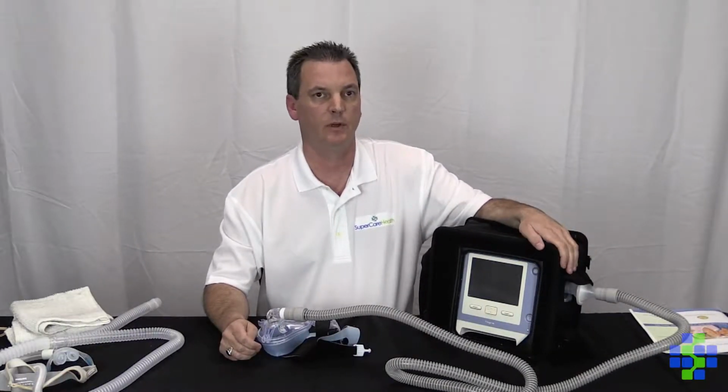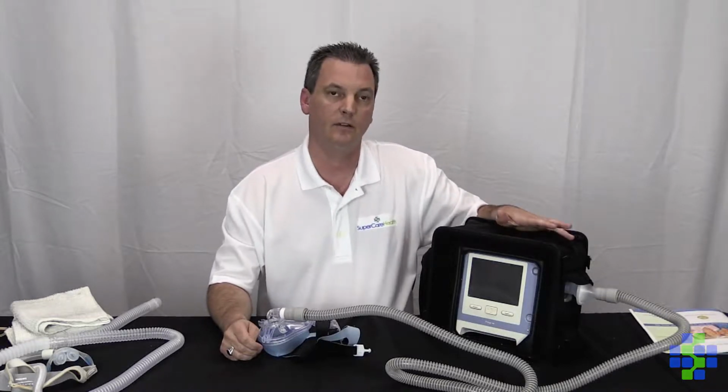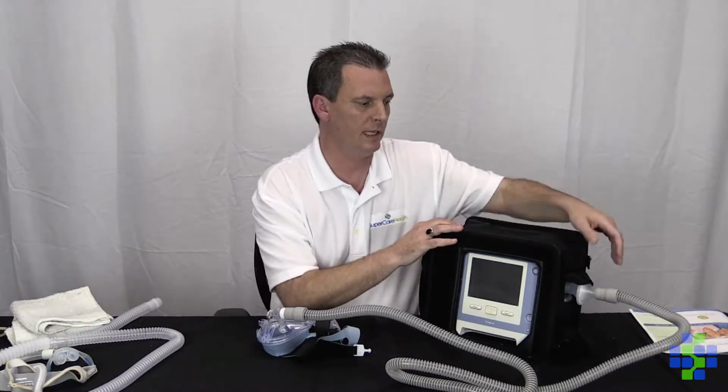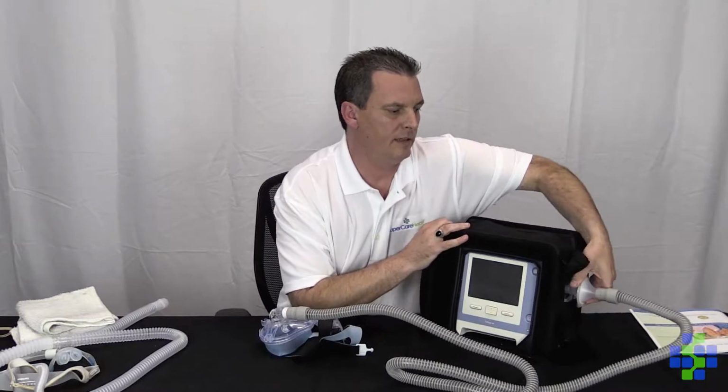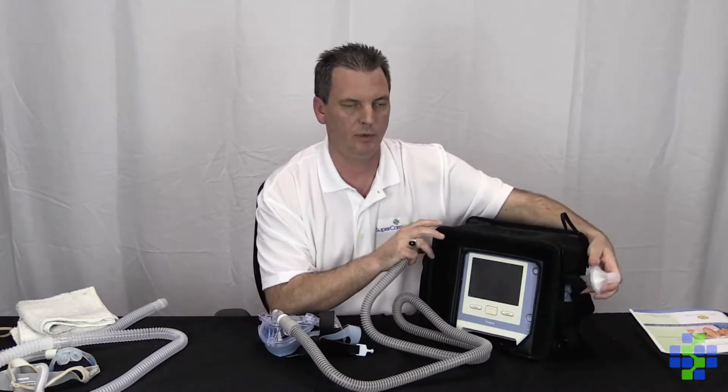I'm a licensed respiratory therapist for SuperCare Health, and I'm here to talk to you about maintaining and cleaning your non-invasive ventilator. So first I'd like to start with the bacteria filter, which is something we never want to get wet. So I'm going to put that back in place.